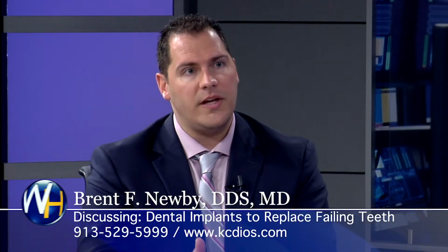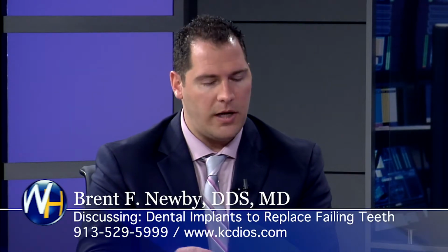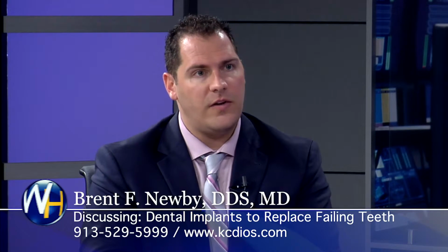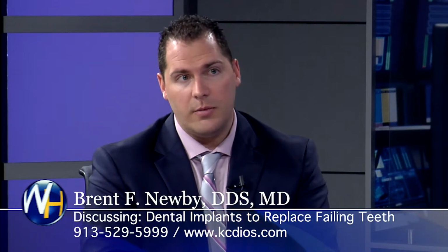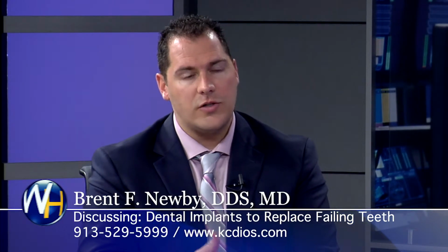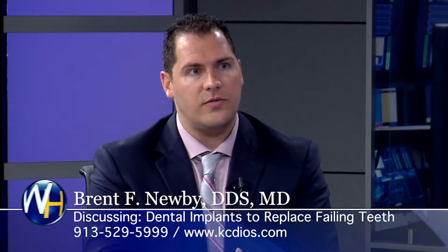So we're able to clean up everything in one procedure, place the dental implants, and the gums now heal because the bacteria and the root surfaces that are hosting the bacteria are now cleaned up. The infection goes away, the gums actually heal and become healthier, they become more viable, you don't have bleeding gums anymore. So actually, on the contrary, these patients are the prime candidates for this type of procedure.